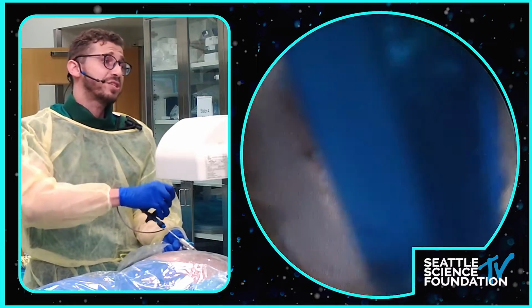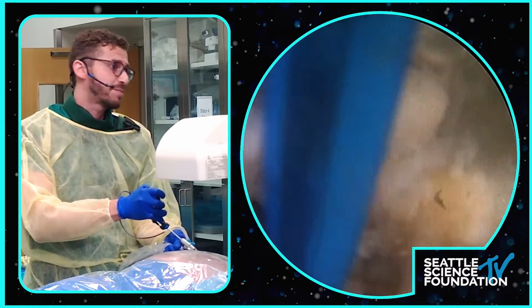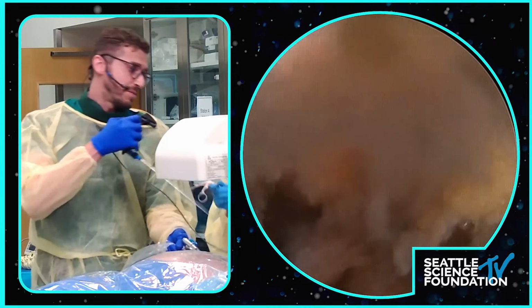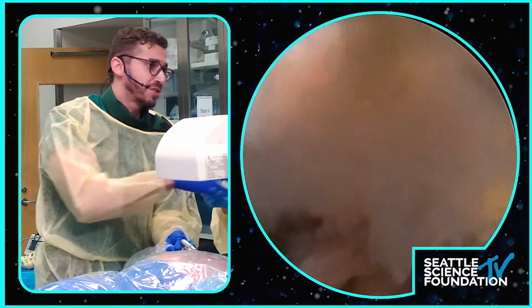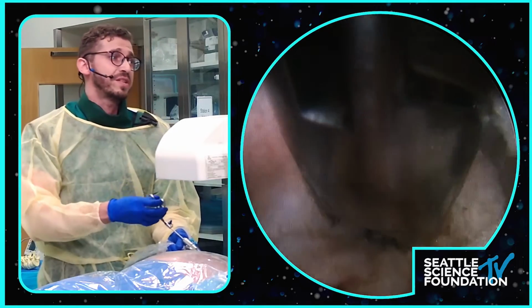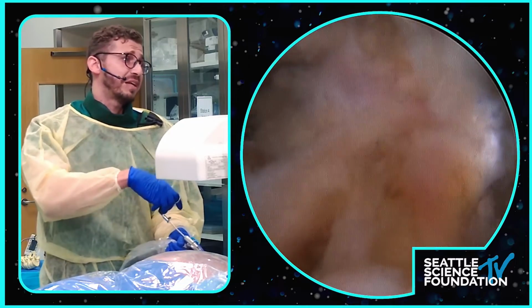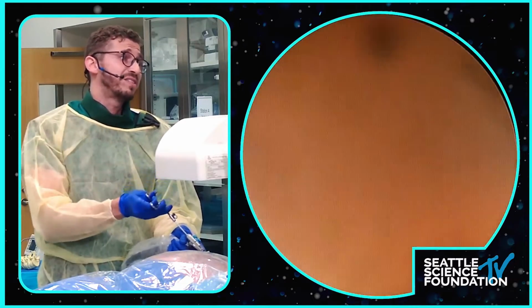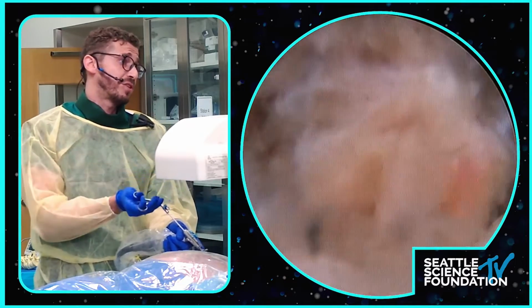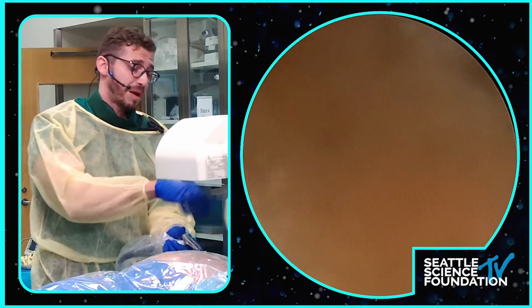In terms of navigation, another thing, honestly, with these transforaminal approaches, especially working in an academic place, may I have a pituitary, please? It's really nice to have navigation for these transforaminal approaches. Looking at the data since I started using it, the number of passes that we've had to get to this spot here has decreased drastically. It's safer for patients, for sure. I think especially if you're in the learning phase, it makes the learning phase better. I can have the bipolar again, please.